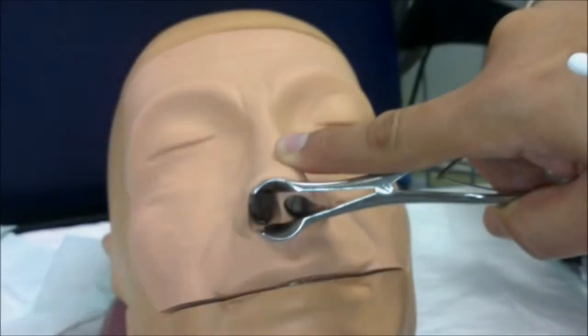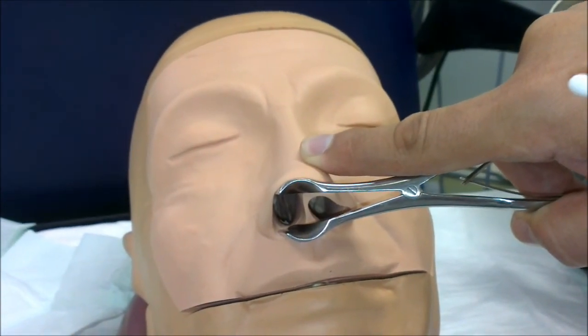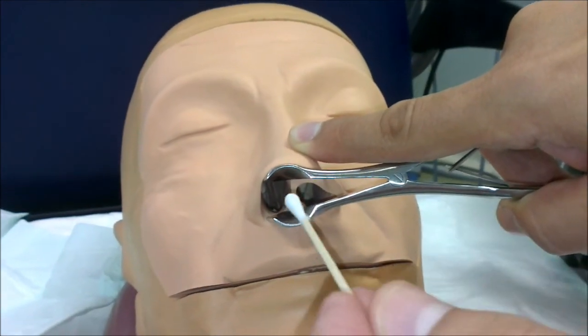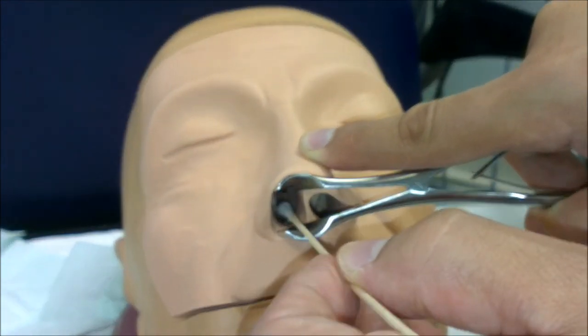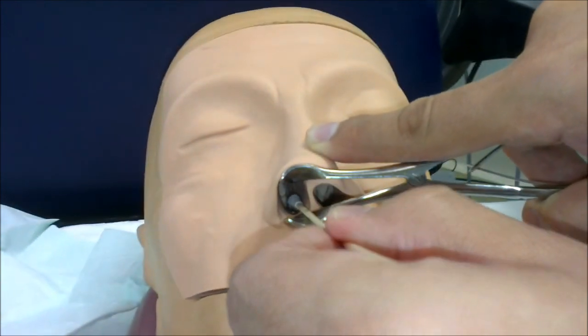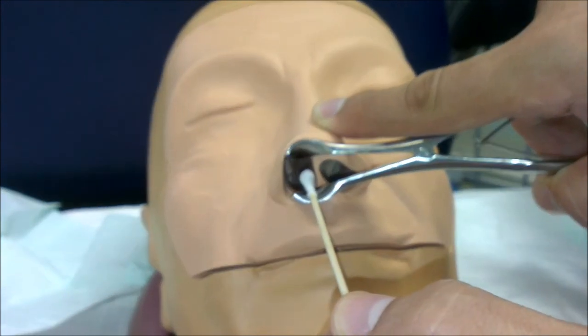The other option is to collect the purulent secretion, if it's evident and obvious, by doing the manual nasal speculum, and then you introduce the swab inside, and once you get purulent secretion around it, you can turn your finger right and left and make it soaked and come out. If there's a lot of purulent secretion, this will be enough for the study.